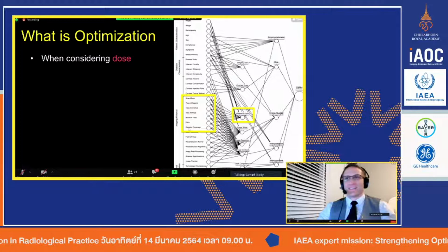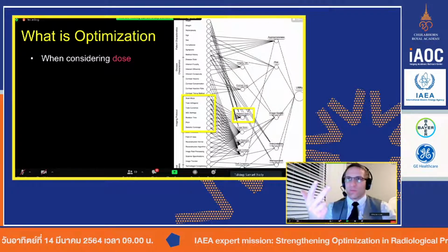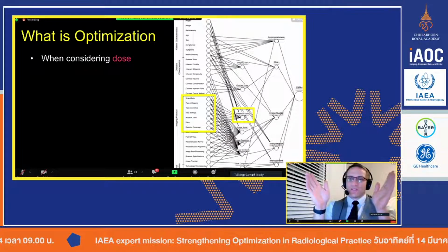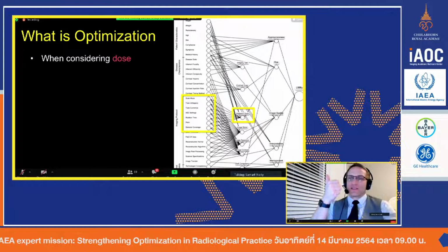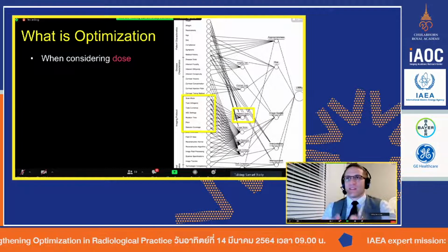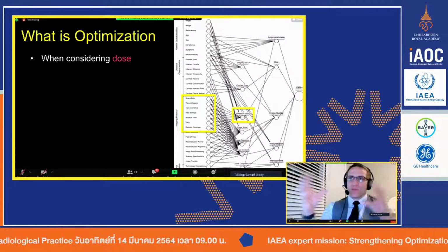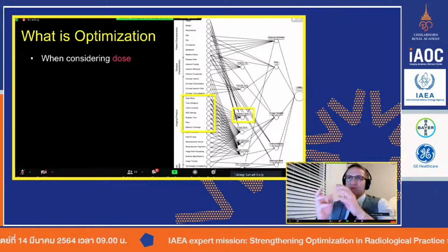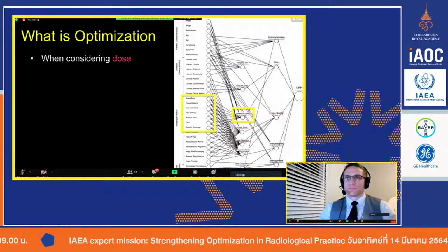And so it takes 3D reformats, image quality, the right amount of dose, the scan field of view. Do we look at organ dose modulation? Are we setting the right appropriateness criteria, the correct clinical indication? There are just all of these things we have to take into account. And it's really good to have a team look at that so no one step is missed, instead of just having the technologist, the radiologist, or the physicist do it alone.